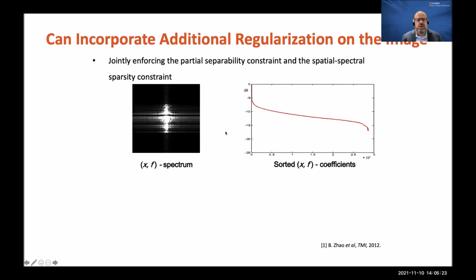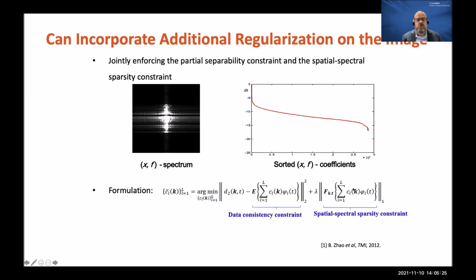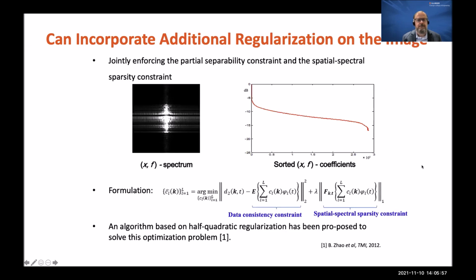You can combine these with constraints too. So as we're estimating those spatial maps, you can say, well, my spatial maps are also sparse. And so that will help us get by with even more undersampling. In the case of the four-dimensional imaging, with the 128 by 128 by 32 by 40, for every single frame, we're basically acquiring one line in K-space. So our undersampling factor is 128 times 32. So really high undersampling factor. So you may want some extra regularization in those spatial maps in order to estimate things that match your prior information on what the image properties of the image should be.